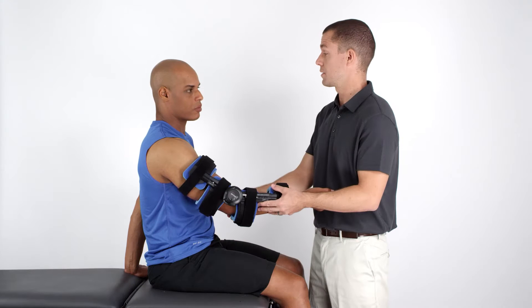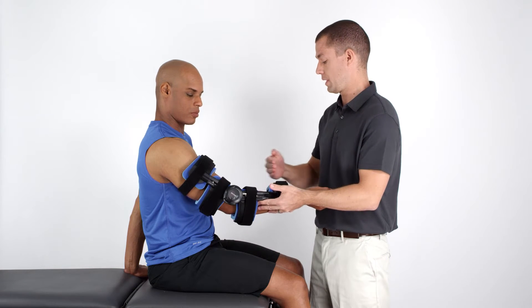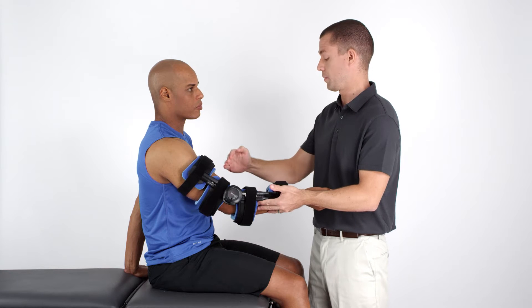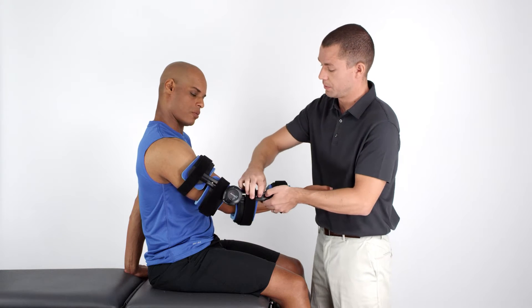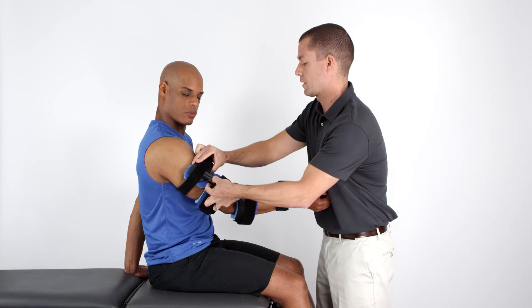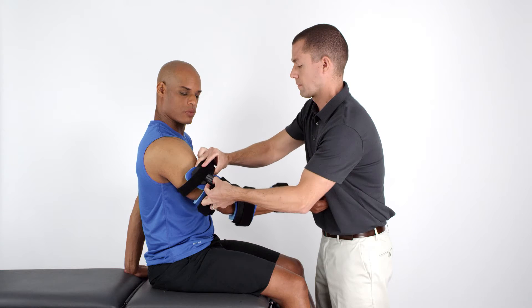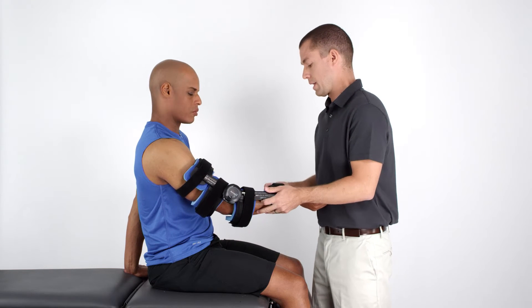To provide a comfortable fit, the Advanced Elbow Orthosis features a unique strut length adjustment capability. To take advantage of this feature, depress the leaf pin on either the distal or proximal strut of the orthosis and increase or decrease the length as needed.